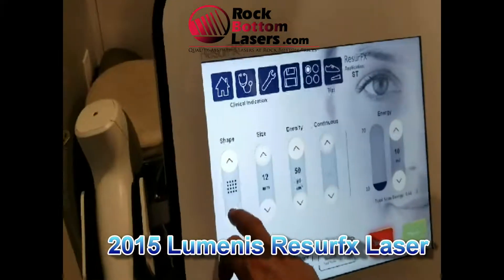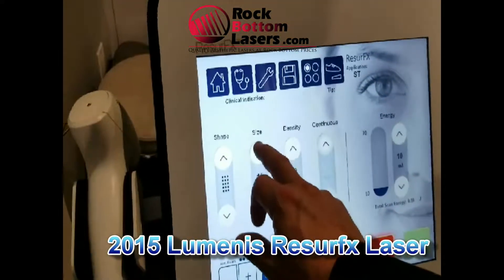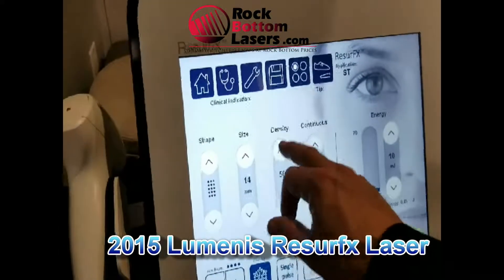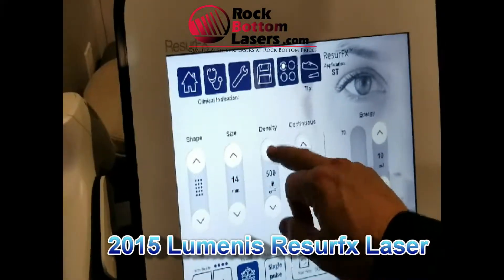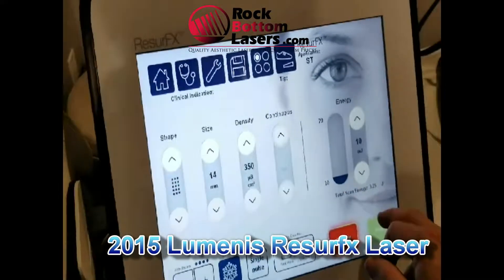Let's just do this. We can go multiple shapes, touch screen is working just fine, size all the way up to 16mm, density — we can increase the density all the way up to 500 microbeams, and continuous mode.